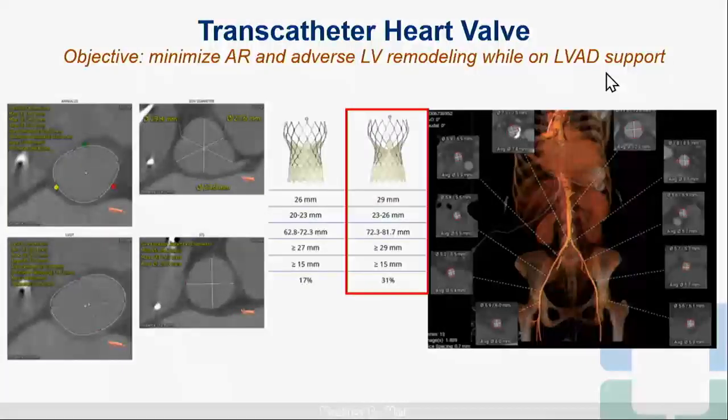So we do our thing, same thing for any TAVR. We do the CT planning, the CT abdomen pelvis, looking at if they have any access issues. We didn't have any access issues. We were above the threshold of 5 millimeter. And then we did the gated CT chest, 20 to 40% systole, looking at the annular size, and a few cuts below, looking at the LVOT.